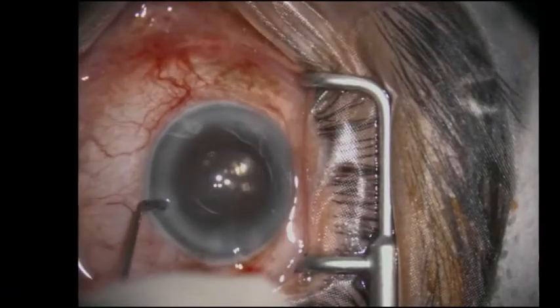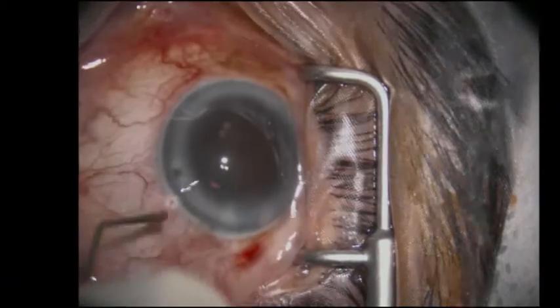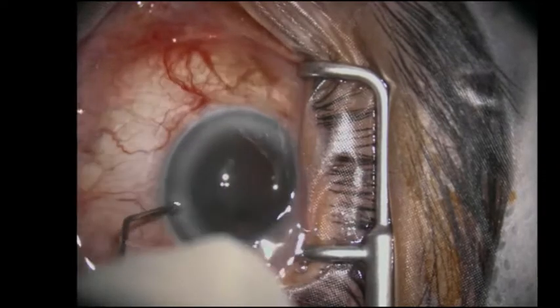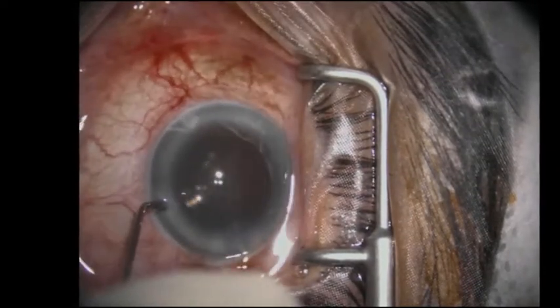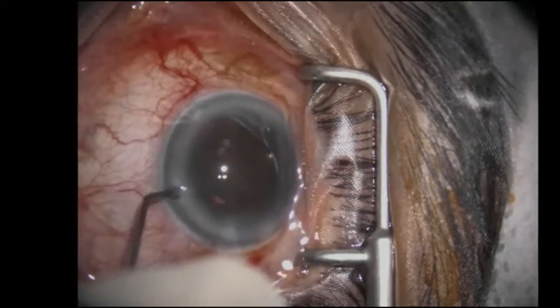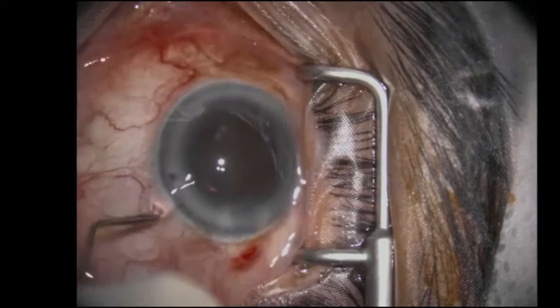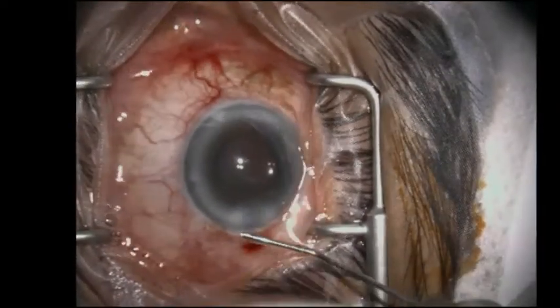Gill's cannula aspiration was used to remove the lens matter placed between the IOL and posterior capsule. In the end, the IOL was well centered in the bag.